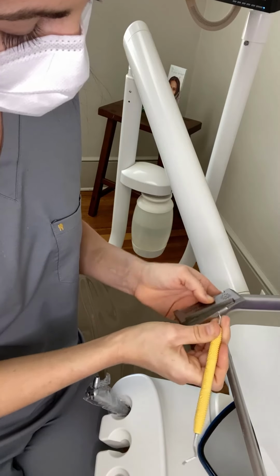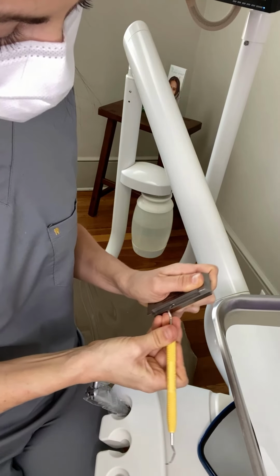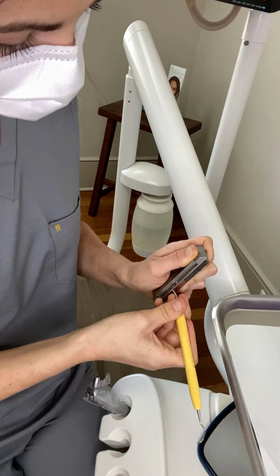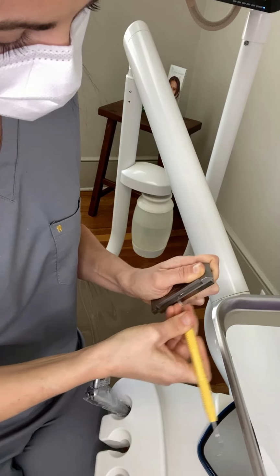I'm going to actually use my bare hands with my instruments because this is clean. My instruments are clean and they will get sterilized once I'm done. So don't come for me. They will get sterilized. But let's learn more about the Gleason guide.